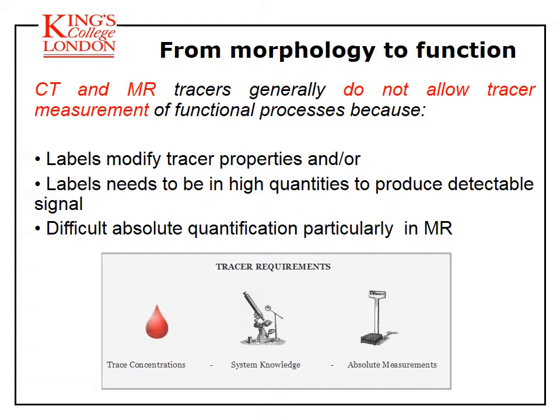MRI is also not that quantitative, in the sense that it is not straightforward to translate the MRI images into images of tracer concentration. Hence, generally, both CT and MRI do not adhere to the first and third principles of tracer measurements.